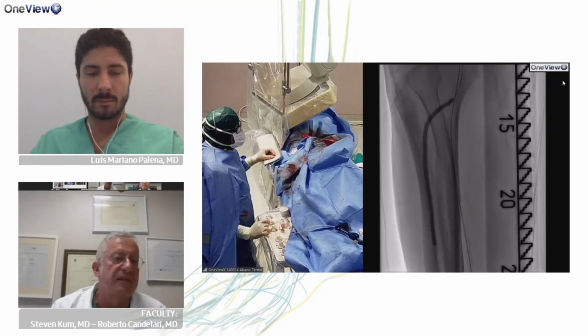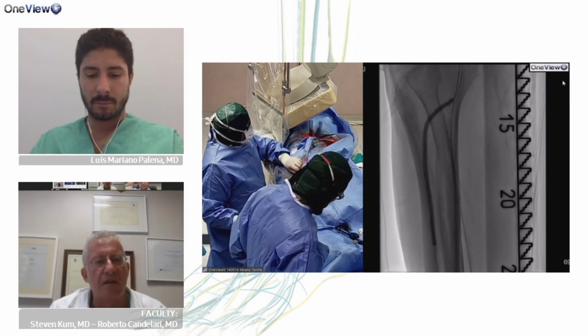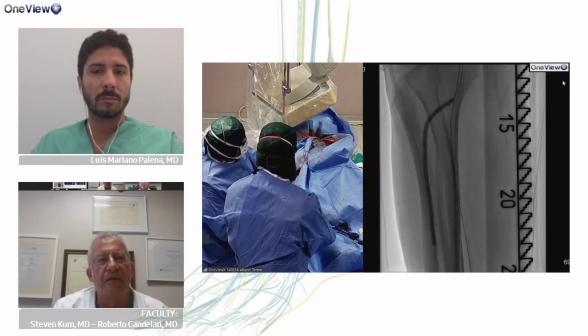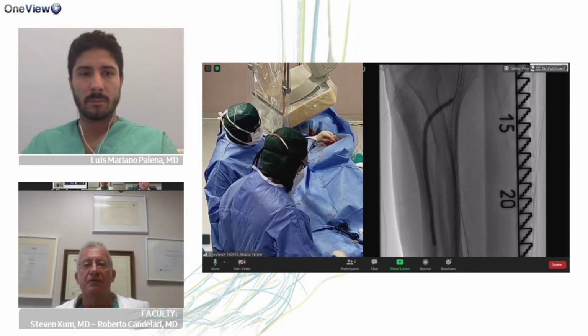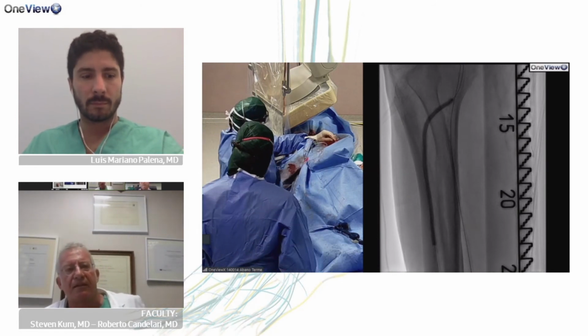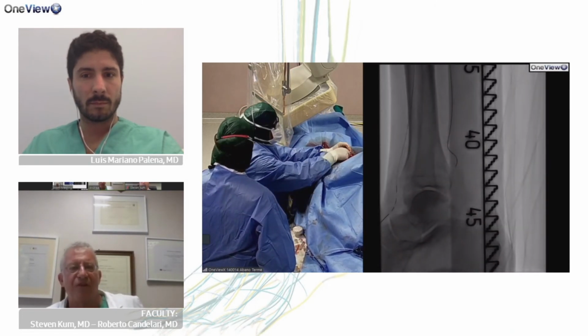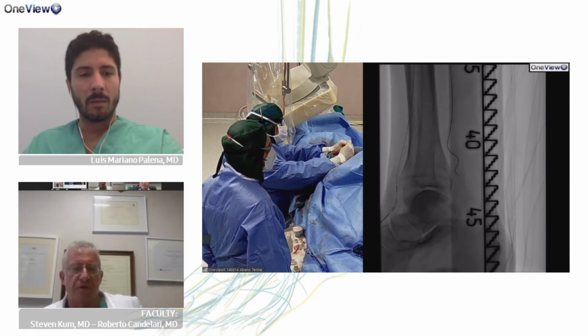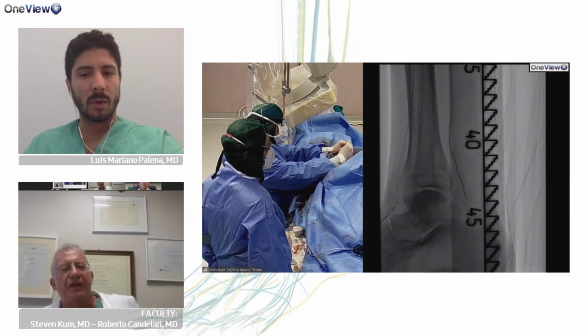Yes, in fact, when you look at the IVUS images, it opens your mind to another world, and all the areas that you can recognize, the dissections, the flaps that you cannot see on the angio just after your procedure. And maybe it's challenging our way to work. In fact, when we use IVUS, we are used to performing more stents, because maybe there are many dissections, many flaps, many possibilities that the flow doesn't gain well, and so we put a lot more stents than before with the angio alone.